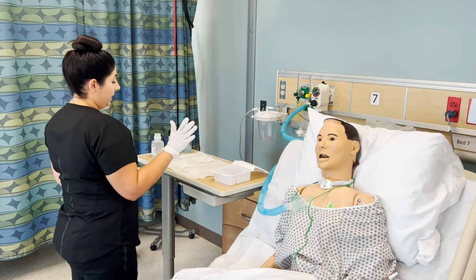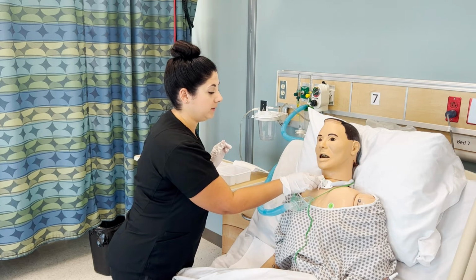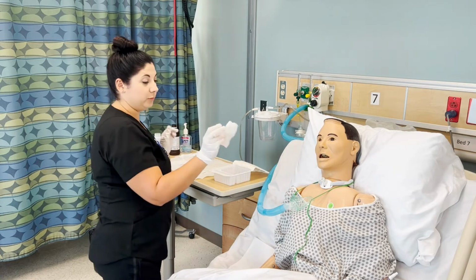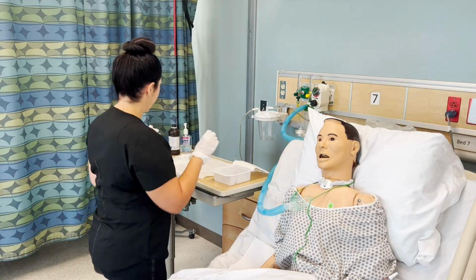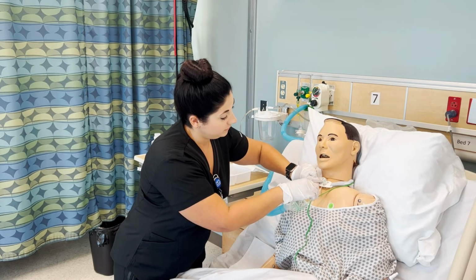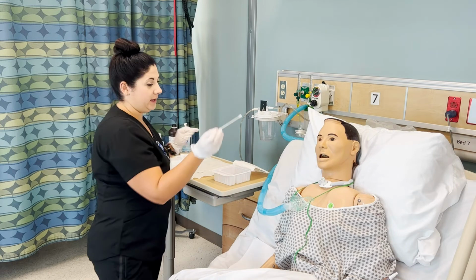Okay. Now we will use our gauze to clean the top of the faceplate. So grab that one that had hydrogen peroxide and saline and clean around the outside, trying not to touch your patient's skin with your sterile hand. And then this will go in the trash. And rinse with the saline. And in the trash. And then underneath, you can lift up a little bit and clean with that Q-tip. Check the stoma for redness, edema, exudate. Once that's clean, that can go in the trash. And rinse with a saline.